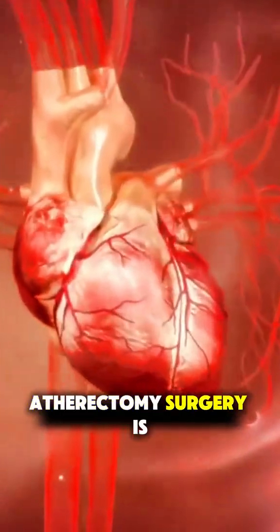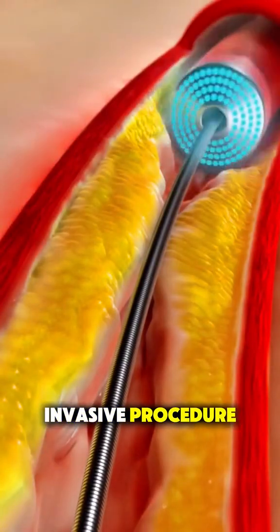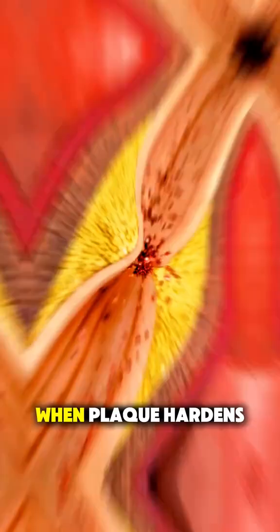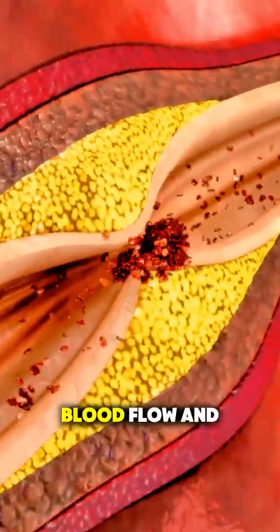Ever wonder how atherectomy surgery is performed? It's a minimally invasive procedure doctors use to remove plaque buildup from your arteries — those blood vessels that carry oxygen-rich blood throughout your body. When plaque hardens and narrows the arteries, it can restrict blood flow and lead to serious problems like heart attacks.